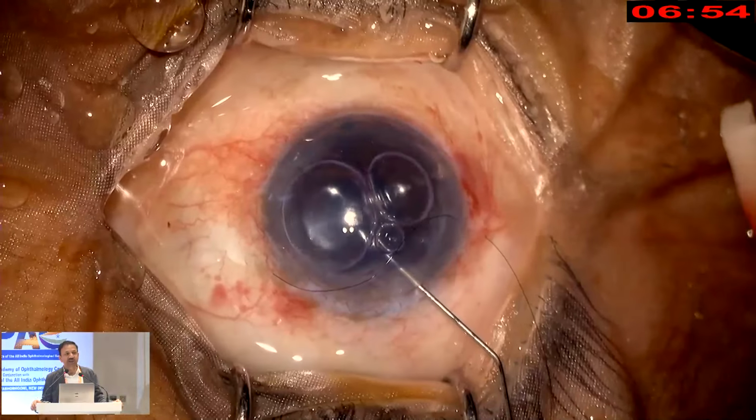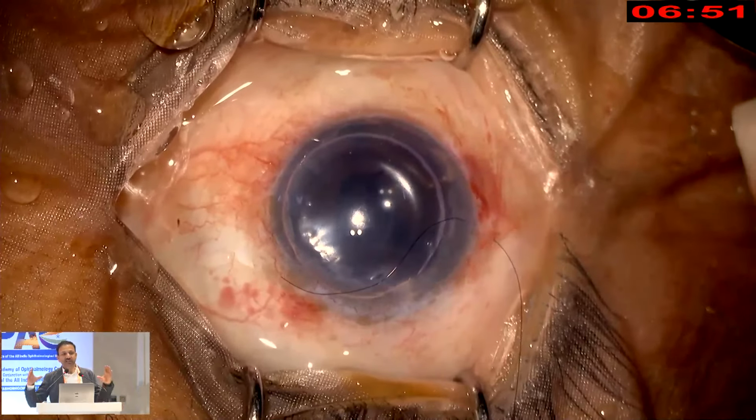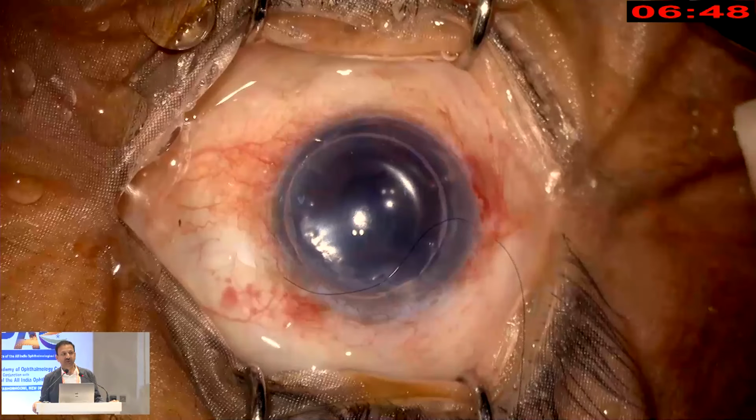This is good for cases where, like this case had an AC IOL, or you have a shallow chamber, peripheral synechia you have released, where if you put in the scroll upside down, you don't have space to re-scroll it, because then you won't be able to deepen the chamber. So in those kind of scenarios, this is good. If not, then you straight away do an ultra thin DSAEK. It will work the same way.